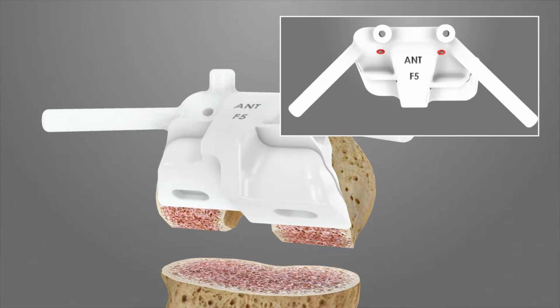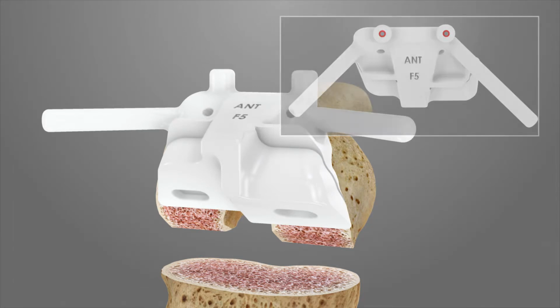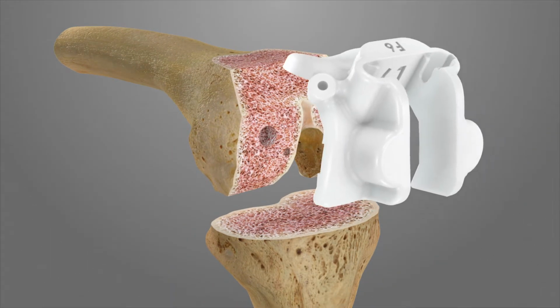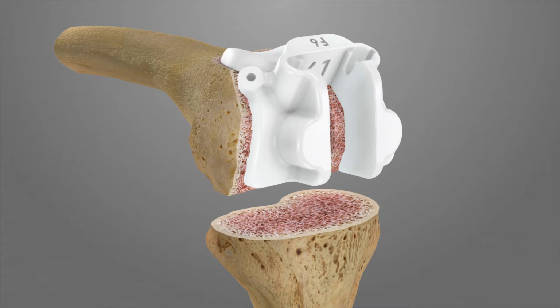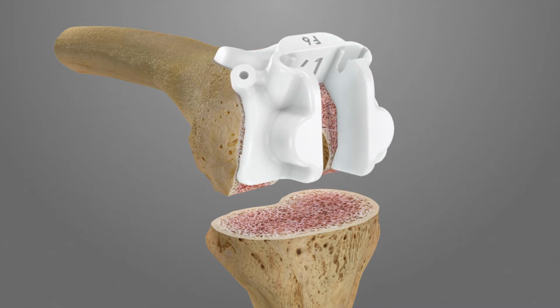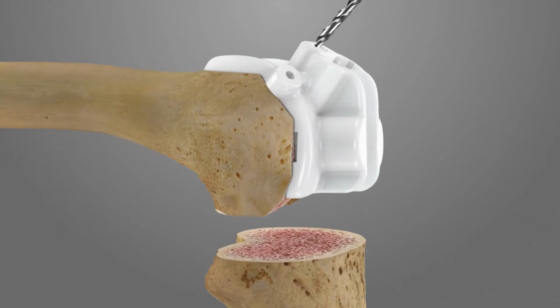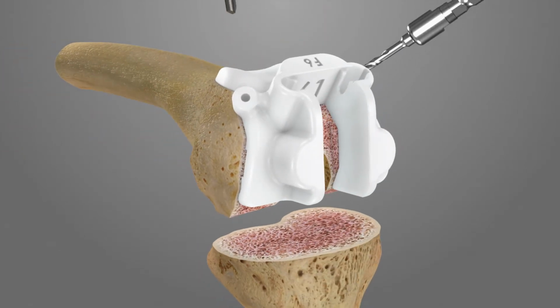If additional resection of the distal femur is required, anterior pinholes on F5 align into the nominal position of the pins set by the distal resection iJig at the original position. Place the box-cutting iJig F6 onto the femur and fully seat it by gently impacting the two small distal surfaces using a mallet. If necessary, revisit the previously completed resections to improve fit. When in final position, the F6 iJig should sit flush in the prepared lug holes and around the femoral bone surfaces. Drill and pin F6 through the crosspin holes.